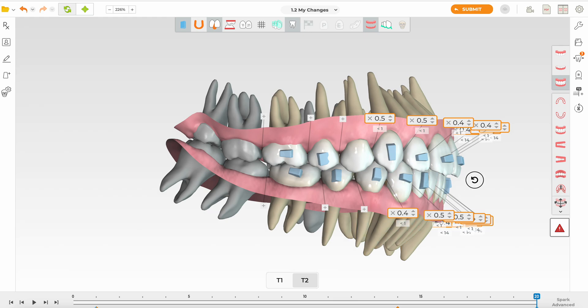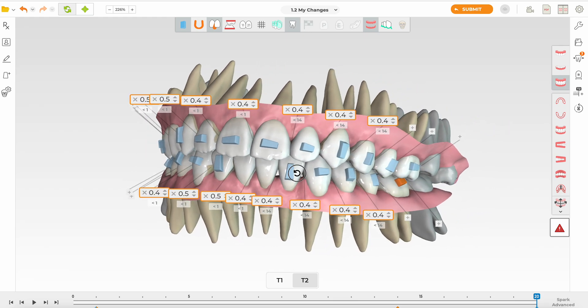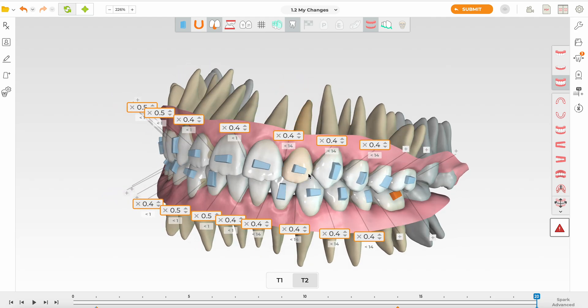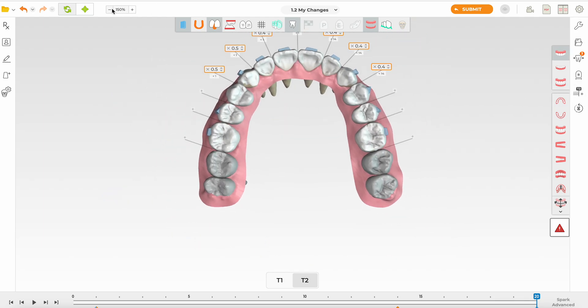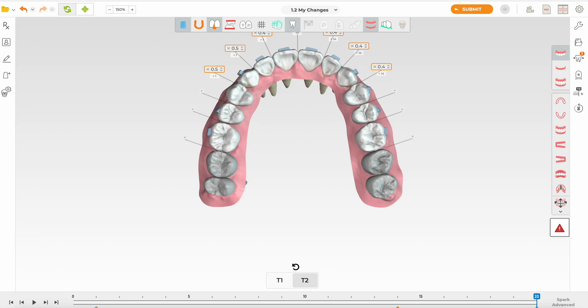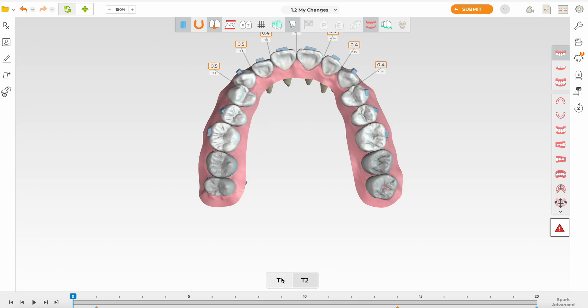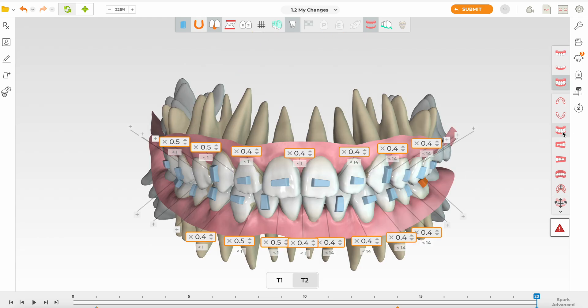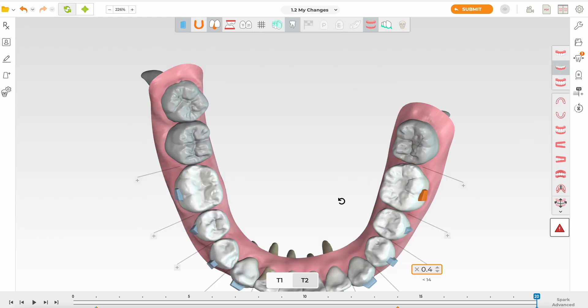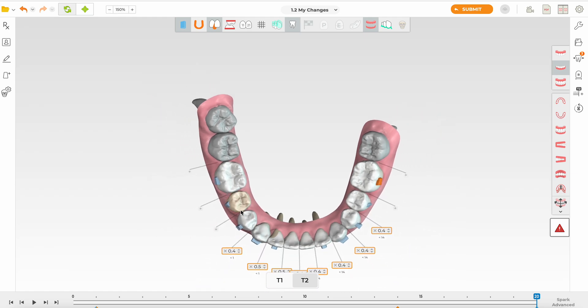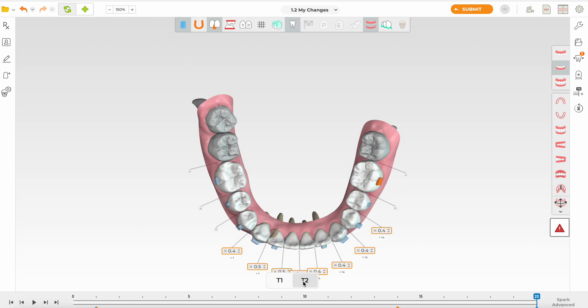The lady does have existing recession and I just want to not expand her too much. So if you have a look, most of the expansion is mostly in that premolar region. And if we have a look at the lower arch here, the horseshoe shape, let's see how much the lower incisors are coming forward. They're not really coming forward that much.